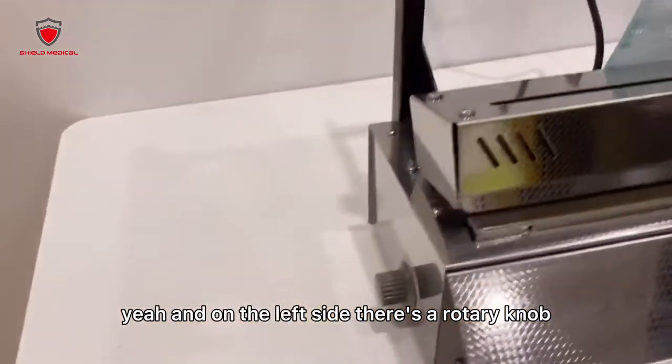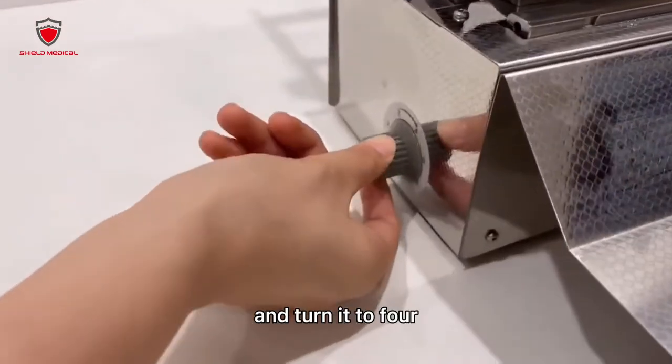On the left side there's a rotary knob, and turn it to 4.